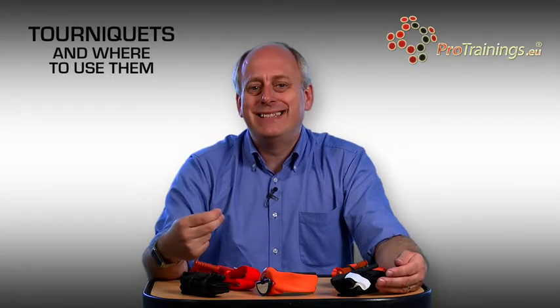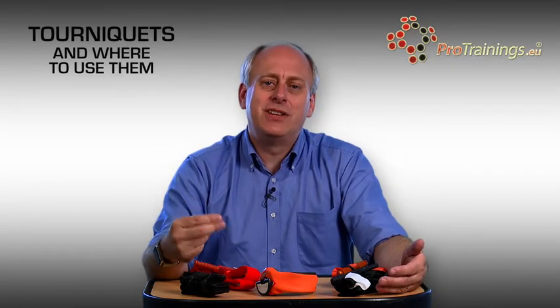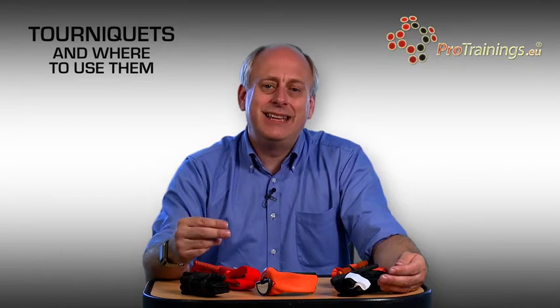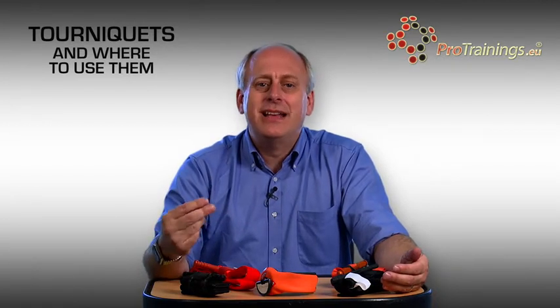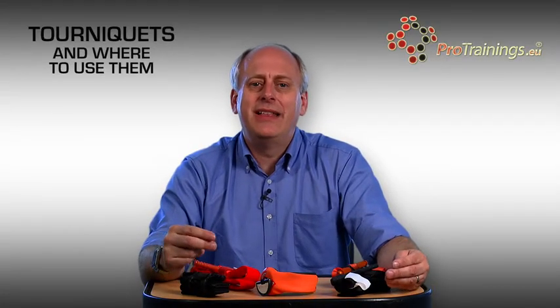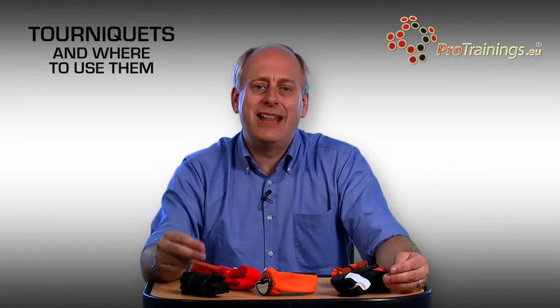When bleeding is very severe, and if the person needs CPR, there's little point in delivering chest compressions if the blood is all forced out of the wound, so we can add a C to the DR ABC. In this example, the C stands for catastrophic bleeding, and it needs to be stopped before we commence CPR. Time is crucial, and we need to apply a tourniquet quickly so that we can treat other life-threatening conditions like cardiac arrest.